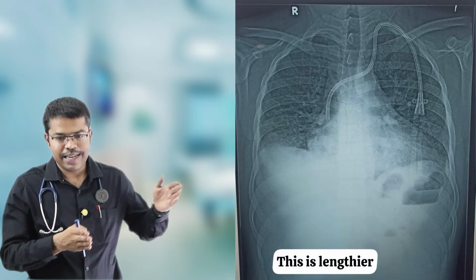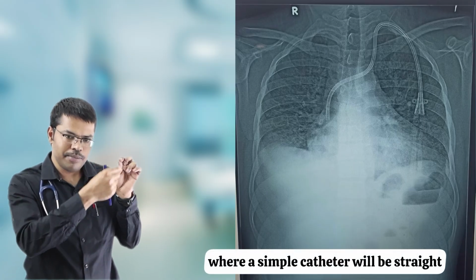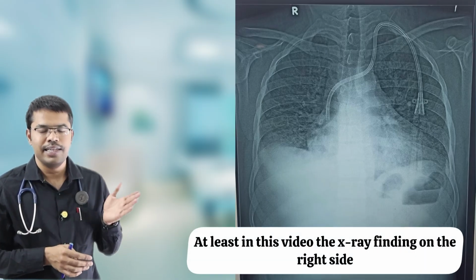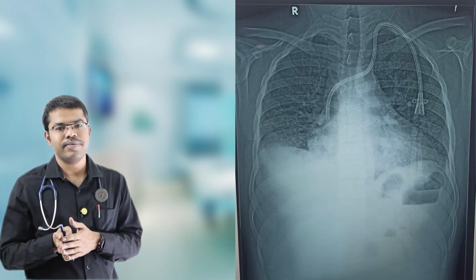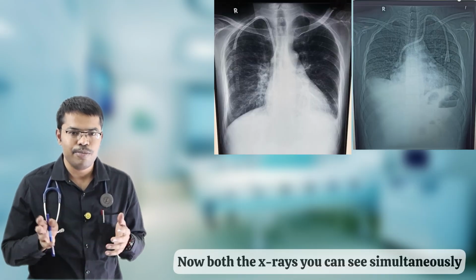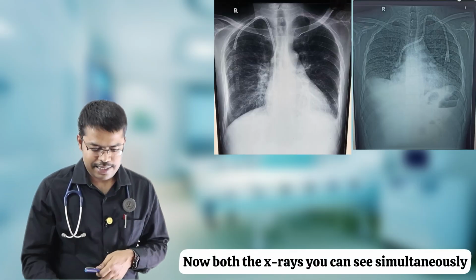This is lengthier, whereas a simple catheter will be straight. You can easily make out. At least in this video, the X-ray finding on the right side permacath and left side, now both are shown simultaneously. Now both the X-rays you can see simultaneously.